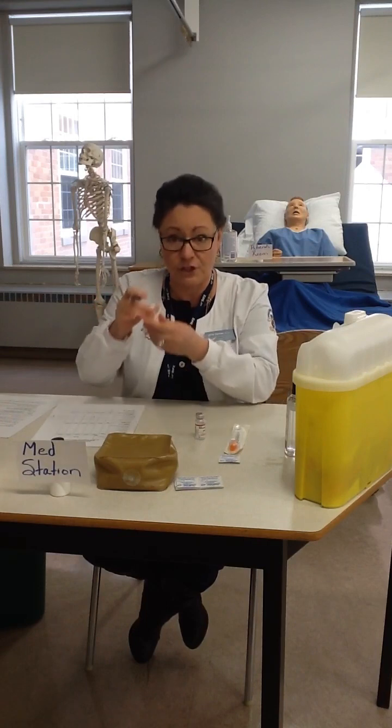I have the right route, subcutaneously. I know that. I've checked his blood glucose level. It's above 5. I know it's safe for me to give this dose of insulin to Jesse. He's consented. I know the right reason. He has the right education. All of those rights have been applied. That's my first check on my first drug.